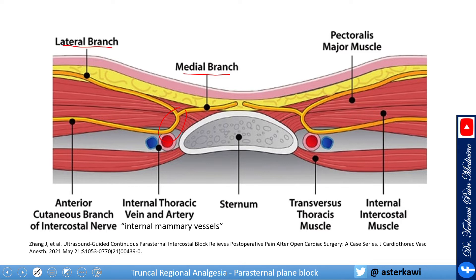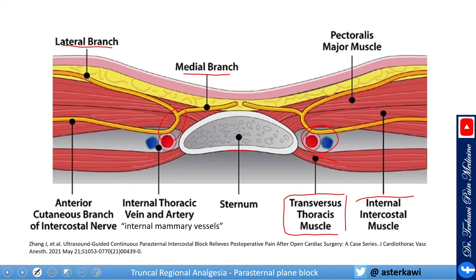Very important to notice here: this is the sternum, and there are a few important muscles, described from deep to superficial. We have the transversus thoracis muscle, with the neurovascular bundle above it, then the internal intercostal muscle above that. The intercostal nerve travels and gives the anterior branch, bifurcating at the fascial plane between the internal intercostal muscle and the pectoralis muscle into lateral and medial branches. This is very important, and we will see why.